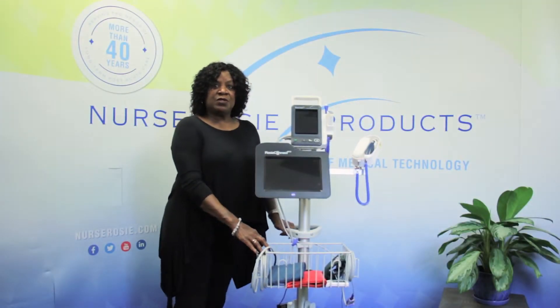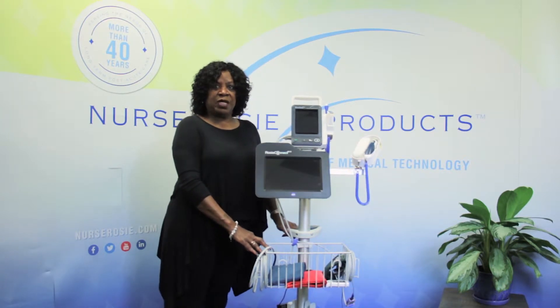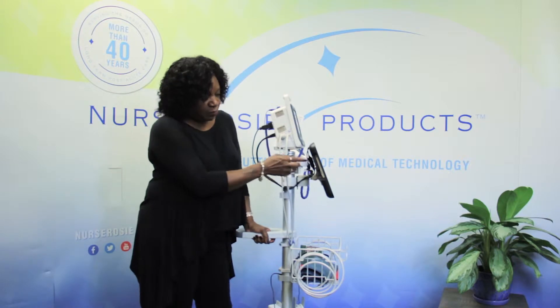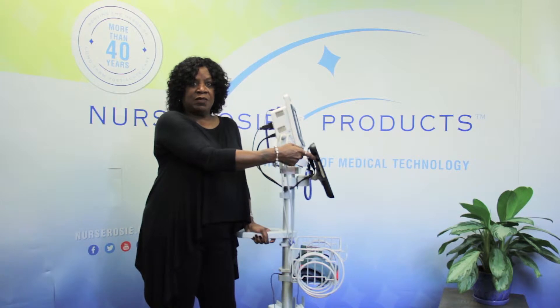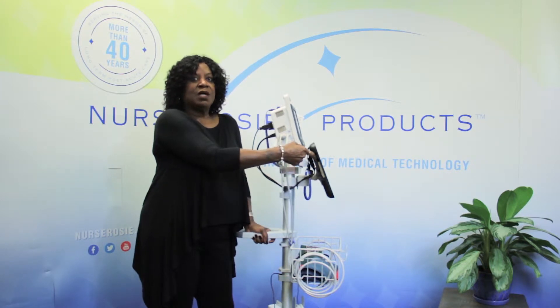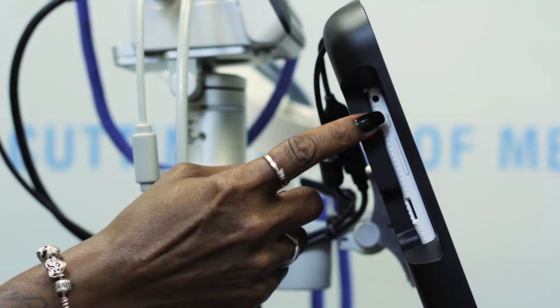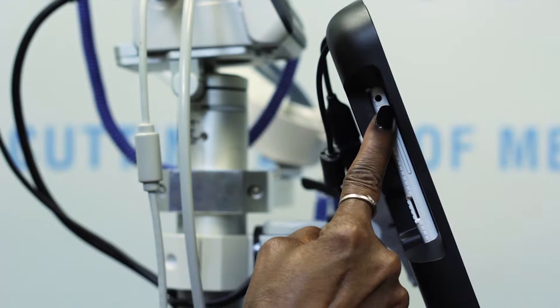Very good. Now that you have turned on your vital signs monitor, let's get your RosyConnect tablet up and running. The power button is located on the left side of the tablet. You will need to turn your tablet around so you can locate the small power button at the top. I am pointing at it now, and when I'm ready to turn on the tablet I will need to hold this button down until the tablet kicks in and begins to power up.